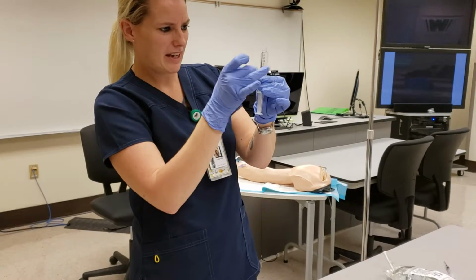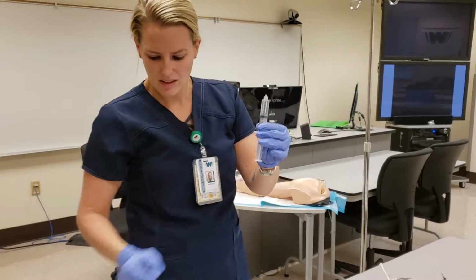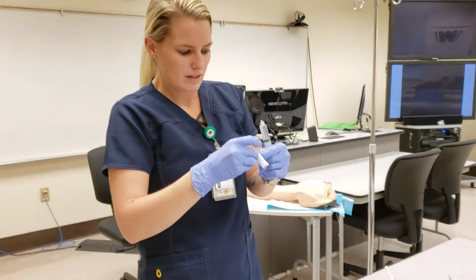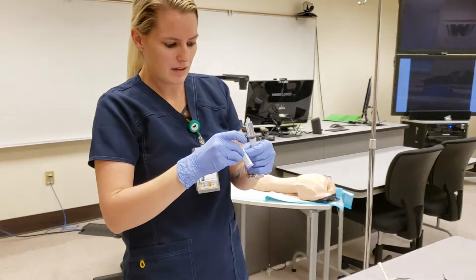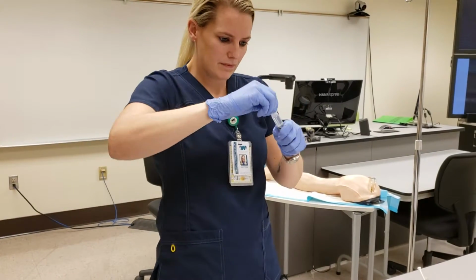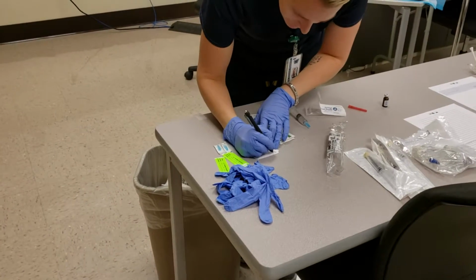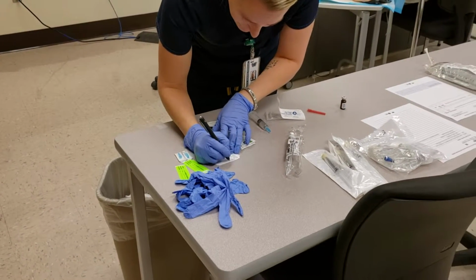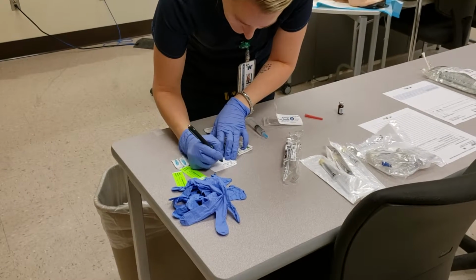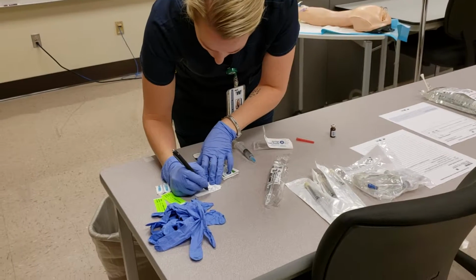To be sure that all of my air bubbles are out. And I would put a blue tip on here. And label this. And it is 0.5 milliliters morphine.